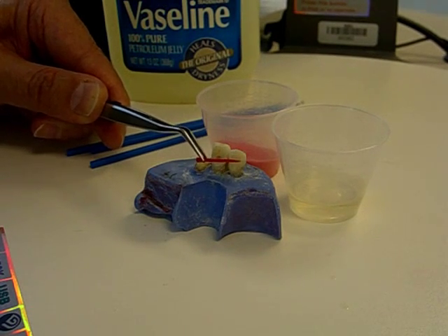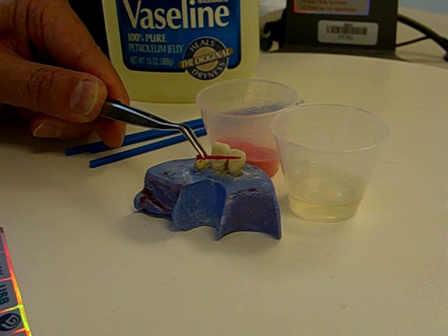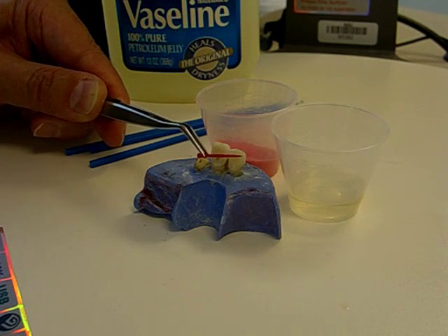Now that this side of the plastic sprue has been wet with the monomer, I'm going to salt and pepper monomer and polymer in very, very small quantities and then try to capture the impression of the post space in small increments.